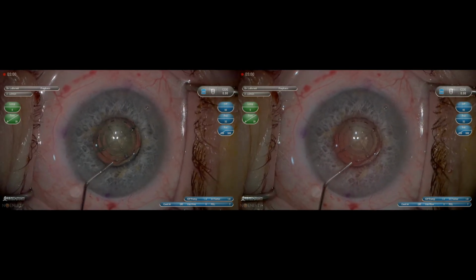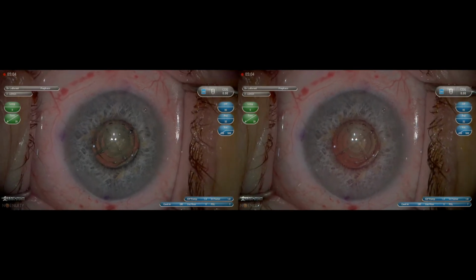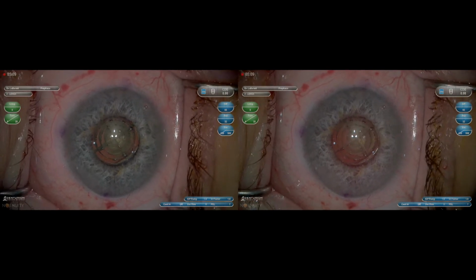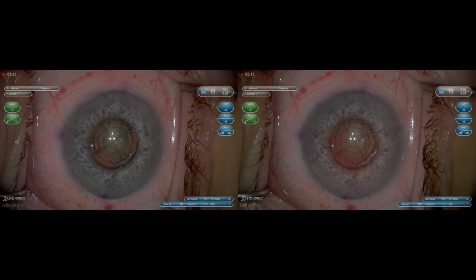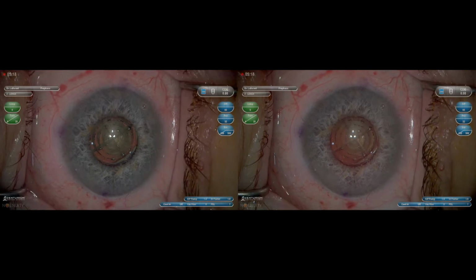In a traditional microscope, you just have the light source and you can adjust if it's oblique or direct light and the intensity. Here you can still do those things with the microscope, but again, the software in the Ngenuity is optimizing your image while maintaining depth of focus in a 3D platform.